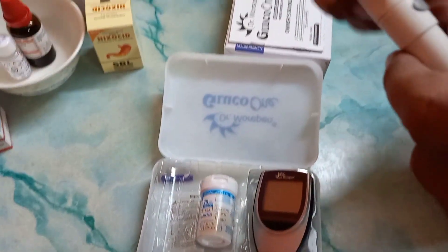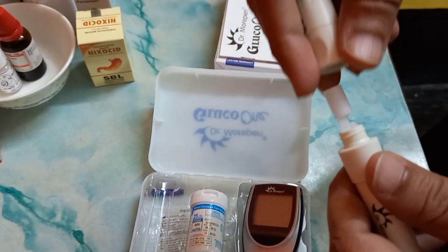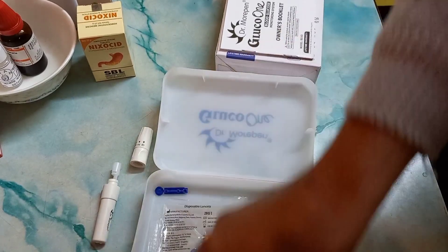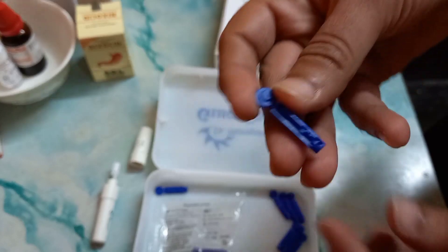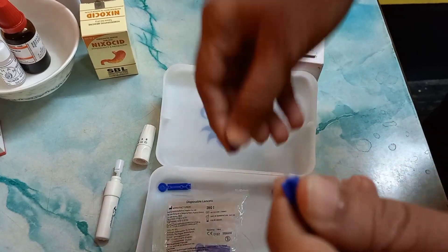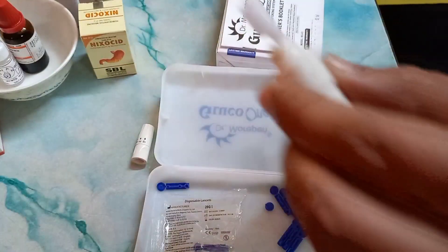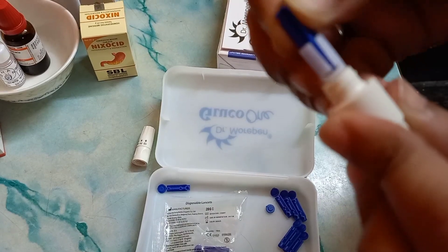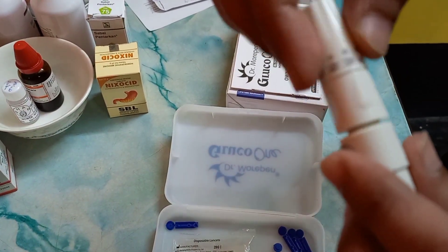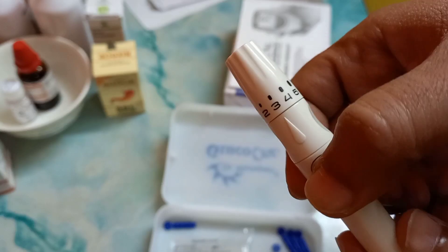Let's check how to use the lancing device. First of all, open the cap. Now take a needle and open its cap — this is the needle. Now put this on the lancing device and close the cap. Now pull it in the forward direction and push the button.